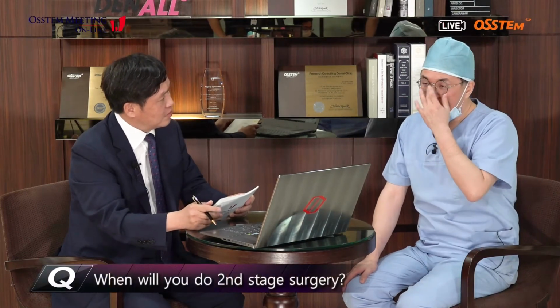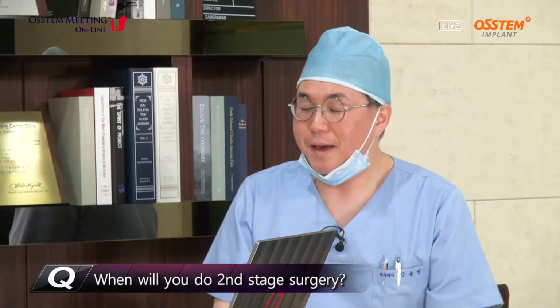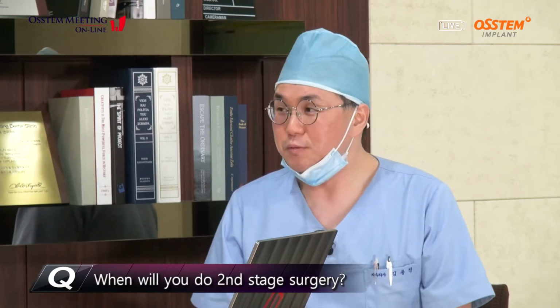Yeah, there are many questions in the live, and the first question is, when will you do the second stage surgery? Usually, according to the defect size, we should decide the appropriate healing time of the GBR. But in this case, I think 4 to 5 months will be enough. So I will do second stage surgery 4 to 5 months after.